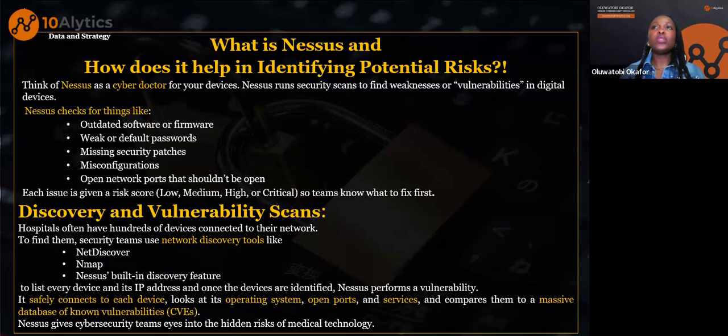Then in the case where maybe they were supposed to have given, so maybe we have Benanaya, we have Ifunanya, we have Oluwaseun as people in the space that work with that machine or that device. And maybe Ifunanya is supposed to be system admin, Benanaya is supposed to be a regular user, and Oluwaseun was supposed to be a manager. And then in configuring, we now give everybody privileges that should only be given to the system admin. That's a misconfiguration, right? That's giving everybody the master key to your house, right? So it checks for these kind of things too.